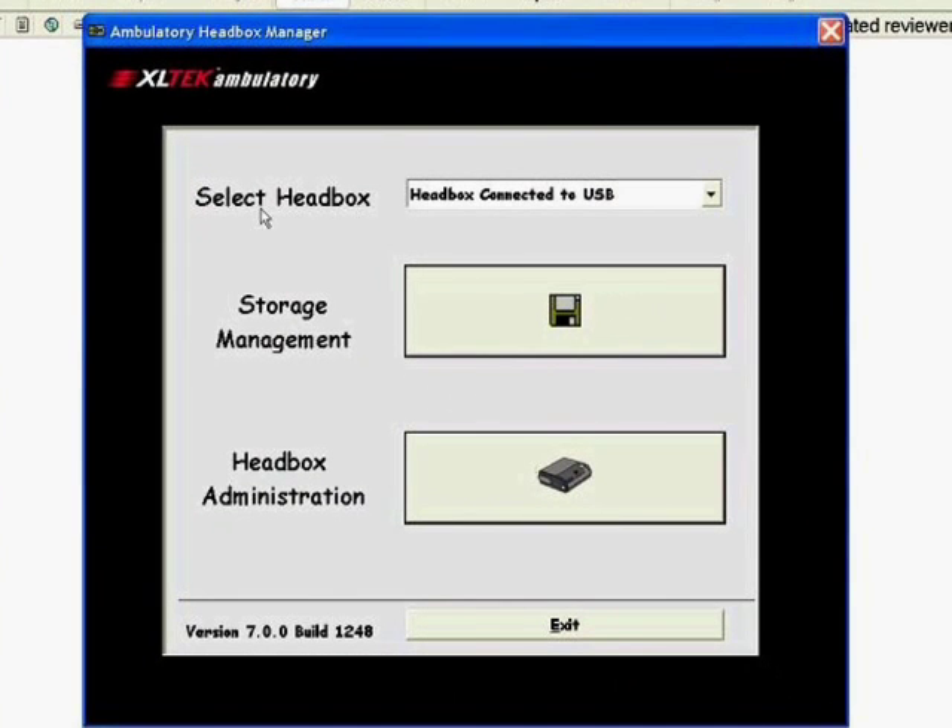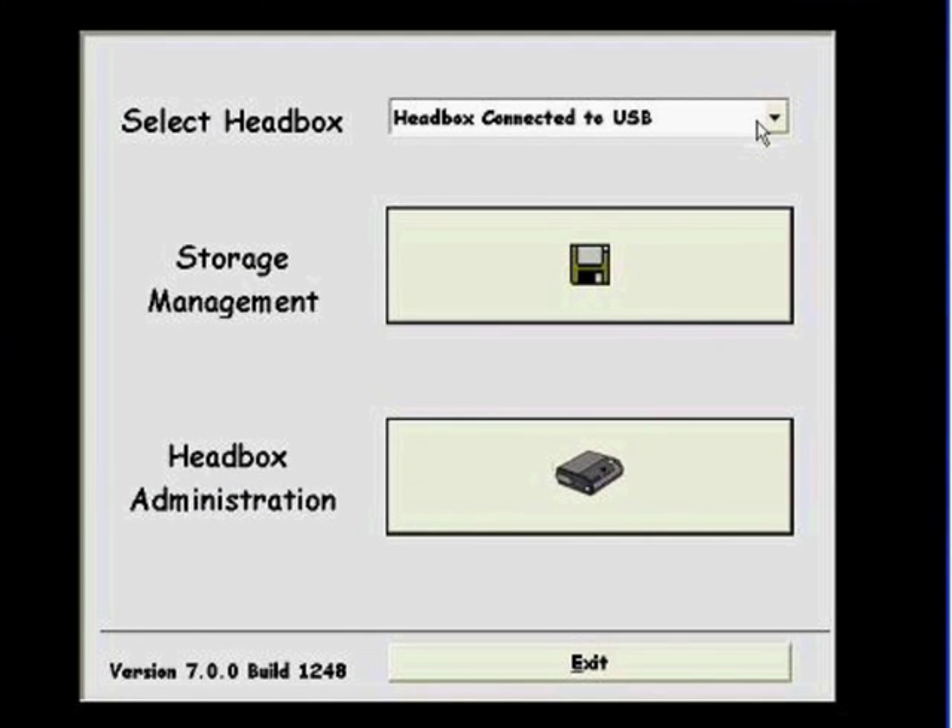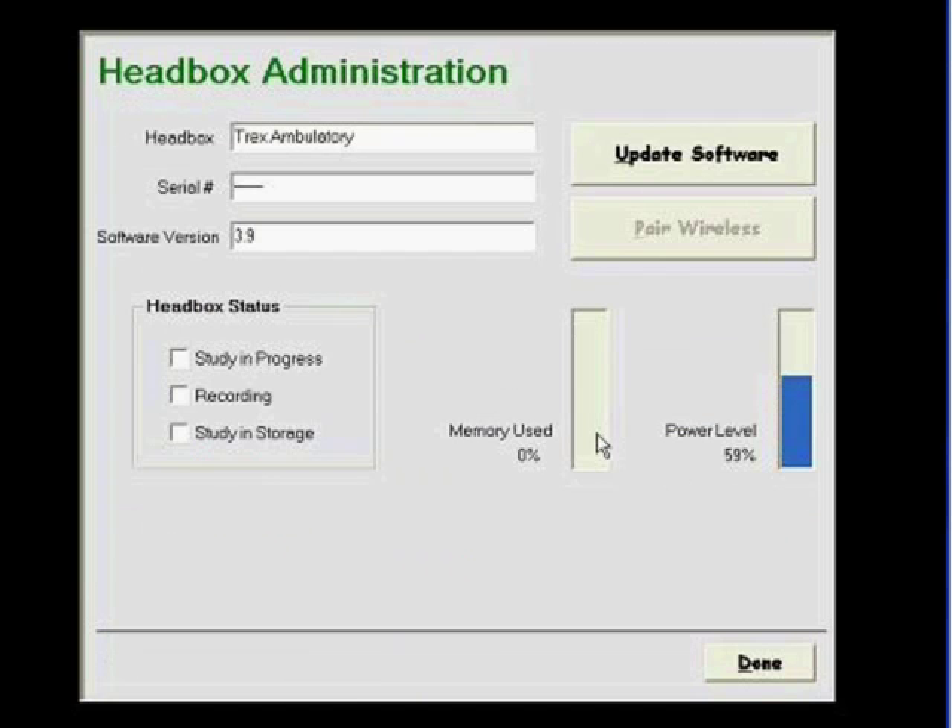Selecting Ambulatory Manager, at the top it says 'Select Headbox' and shows the headbox connected to USB. Clicking Headbox Administration tells us what the headbox is, displays its serial number, the software version on the headbox, and its status. If a study is in progress or recording, you would see a checkmark. It also shows what percentage of memory has been used and a power indicator for the batteries currently in the Trex.